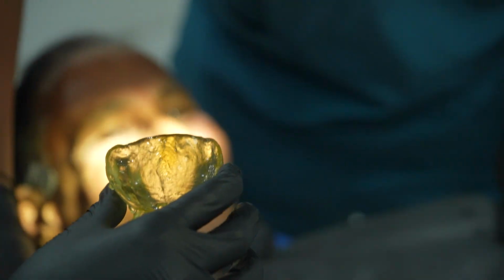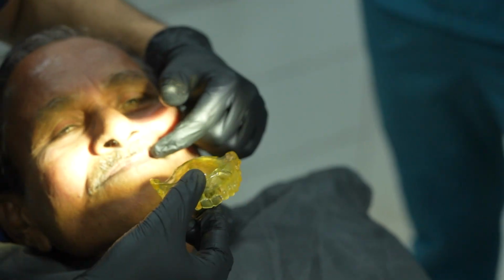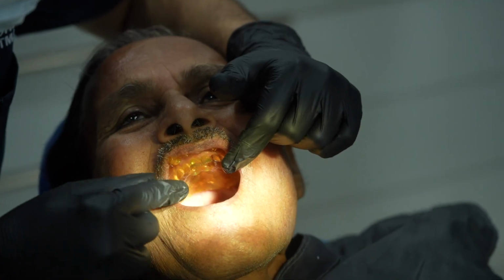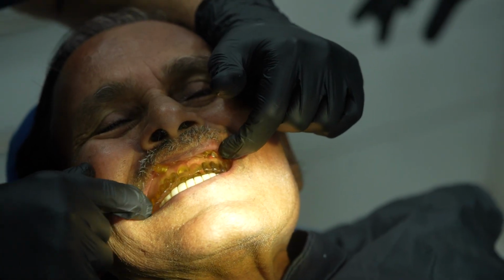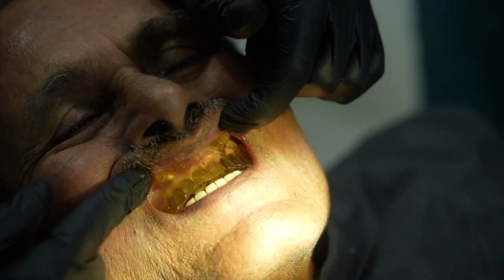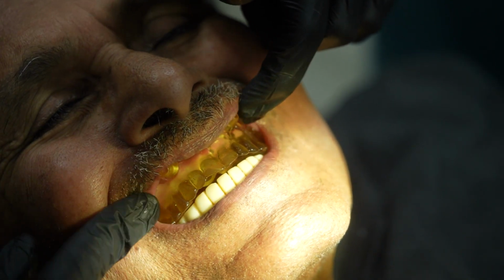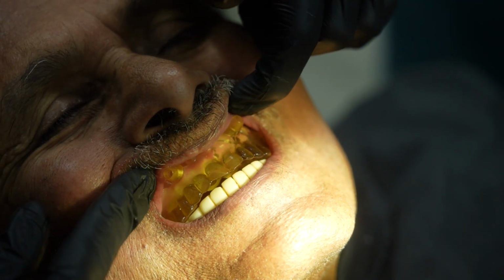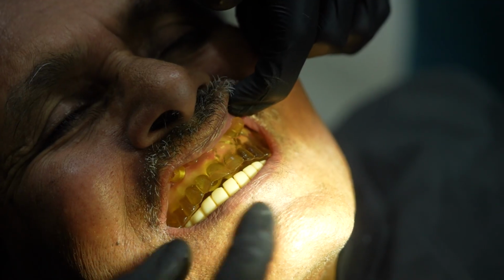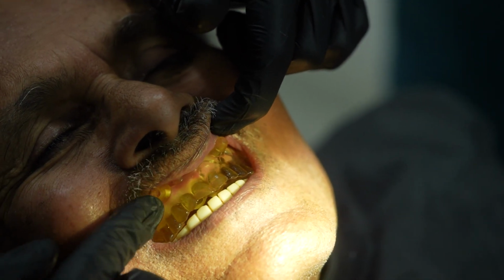So now we will first stabilize our guide. How do we stabilize our guide? You can first see whether your guide is properly seated. Since I told you it's a denture based guide, we already know how his denture was seating, exactly like this. So it gives you an idea whether your guide is properly seated or not. Now I will ask him to keep it like this, and then I will drill for my stabilizing screws.